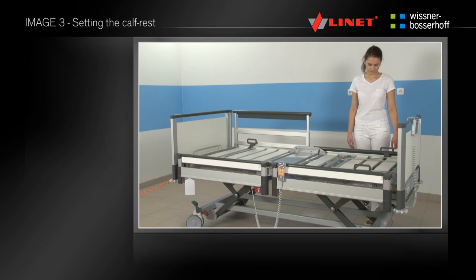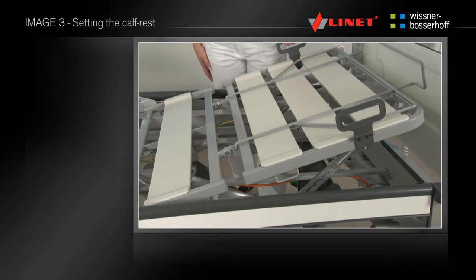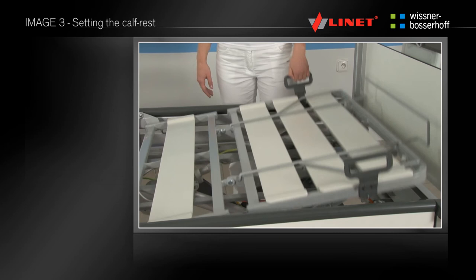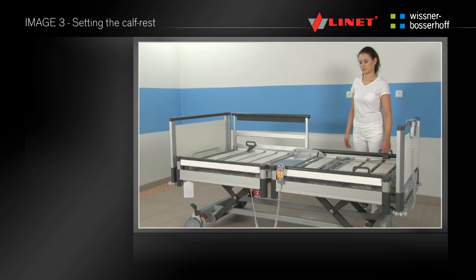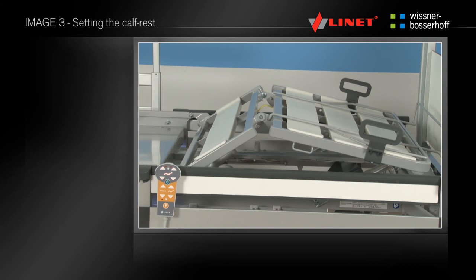The calf rest can be mechanically adjusted to the optimum height. Raise the calf rest slowly with the handle located on the calf rest of the mattress platform — the calf rest is secured automatically. Slightly lift the calf rest and then run it down to release. The calf rest can also be raised when the thigh rest is positioned, giving the patient raised legs and bent knees.